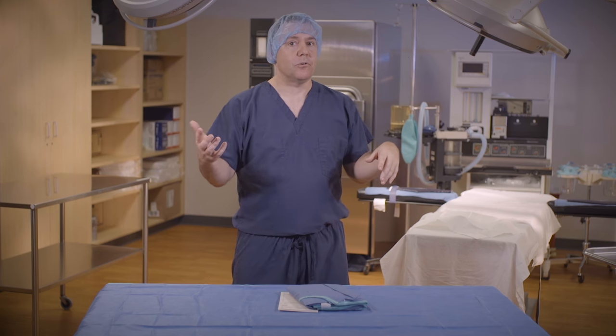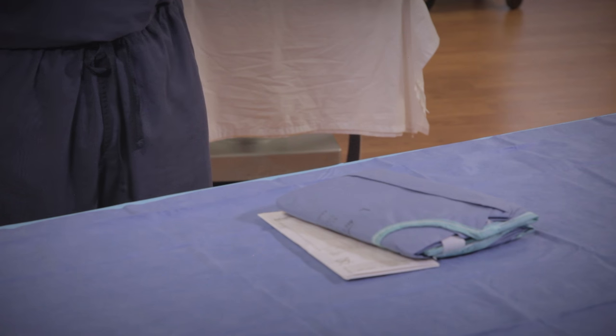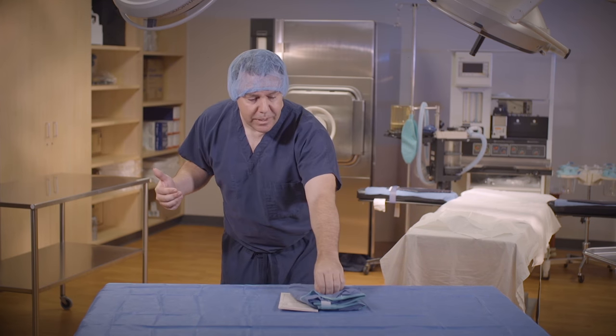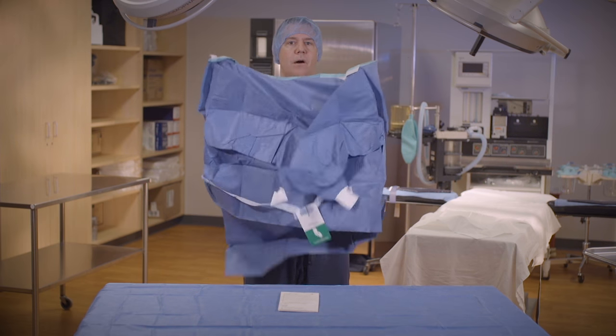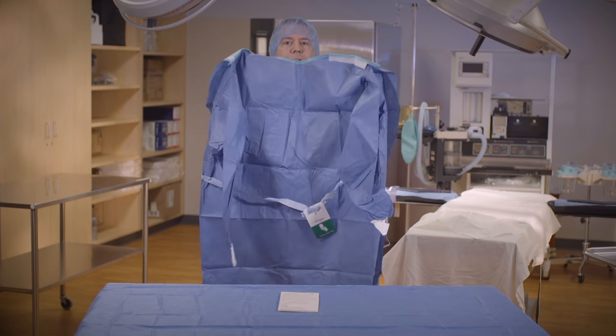I think the best way to do this is to look at the gown before you pick it up. If the cuff of the gown is on the left side, pick it up with your left hand. If the cuff is on the right side, use your right hand. This cuff is on the left, so I'm going to use my left hand to pick it up. Be sure that the gown remains folded as you back away from the field. Continue to always face the field.